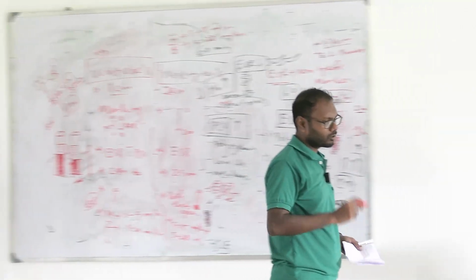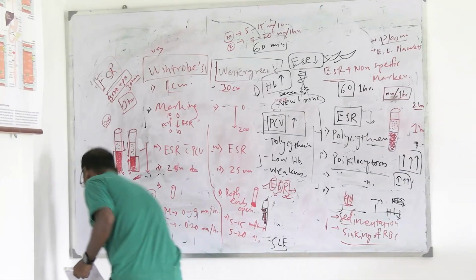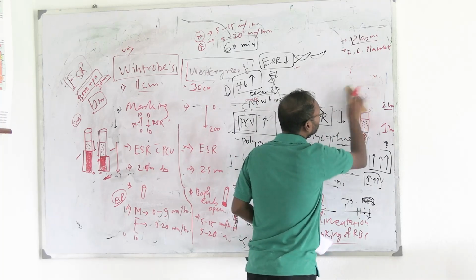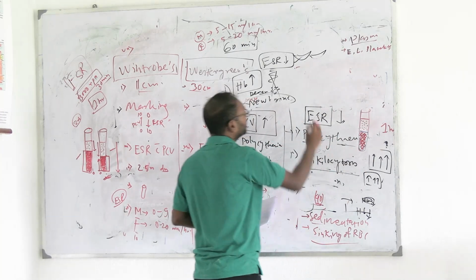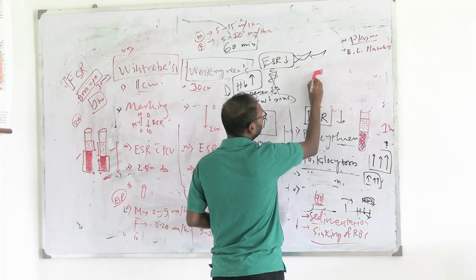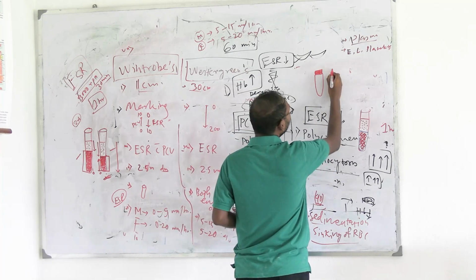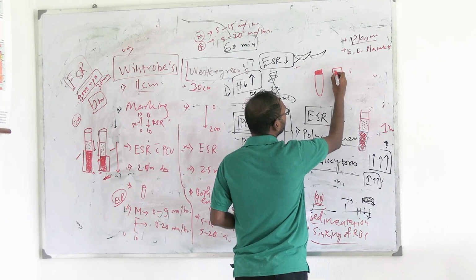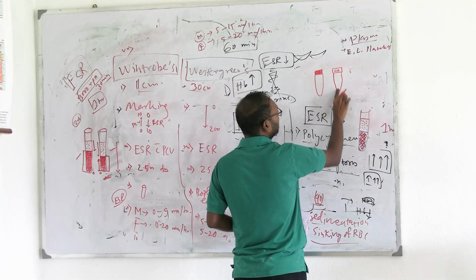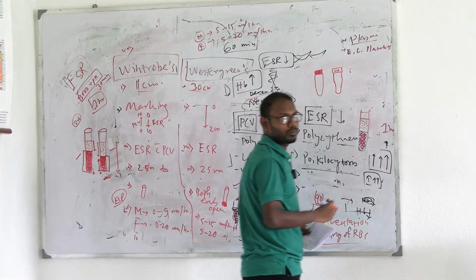Now আমরা যখন তোমরা নিশ্চয়ই বিভিন্ন টিউব দেখেছো, those are blood tubes. Okay, some tubes are actually different colors in their top. According to them the tubes are placed. So there are red top tubes. Then again another you have seen violet top tubes. And again যেটা আমাদের ল্যাবে আমরা ইউজ করি ওই টিউবটাকে কি বলে হেমাটোলজিক্যাল প্র্যাকটিক্যালে EDTA টিউব, তাই তো?